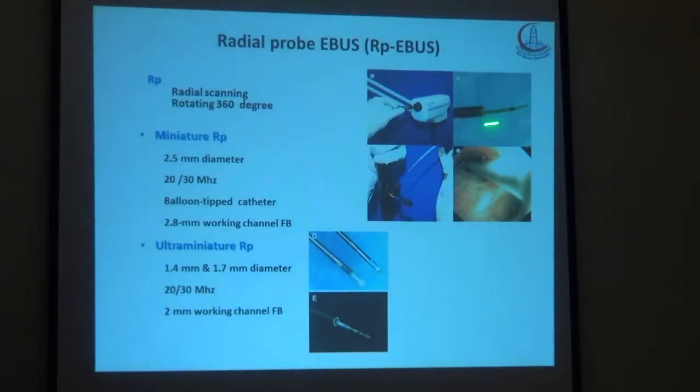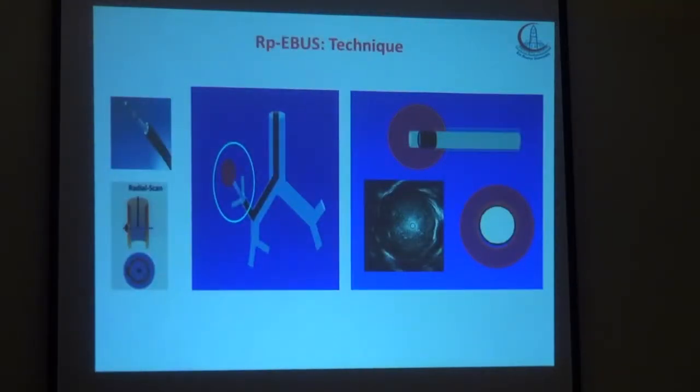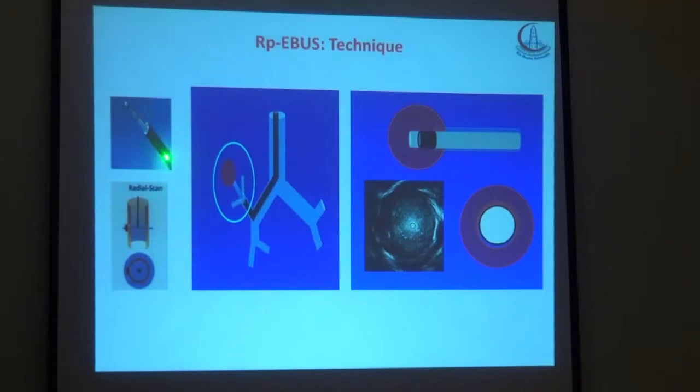وهو ده السيستم بتاعها غير الثاني المعقد، ان انت بتدخل الريتش دي كده، وبعد كده بتطلع من المنظار، بتدخلها بقى في الوركينج شانل من المنظار، وتدخلها من غير بالونه خالص، وتزقها وتبتدي تشوف السونار بتاعتها. هي الفكره بالظبط كده، ادي المنظار وادي بروب، بتدخل المنظار وبعدين عندك الليجن بتطلع السونار بروب، بتخش تتحرك تشغل السونار يعمل لك راديال ايمج 360 درجه يوريك الليجن اللي موجود.